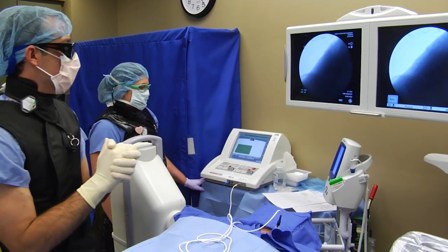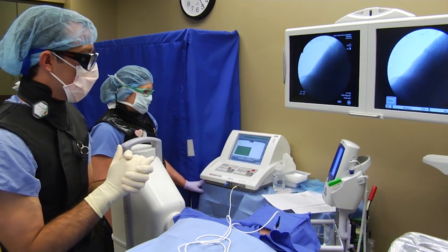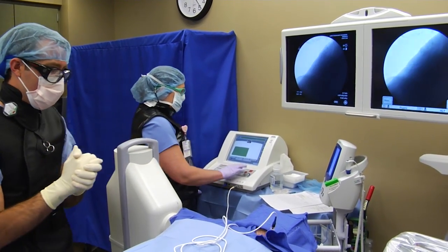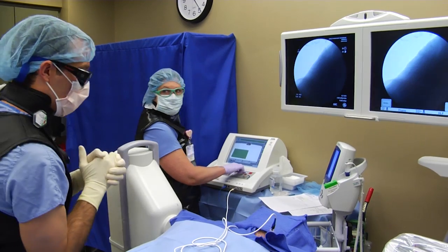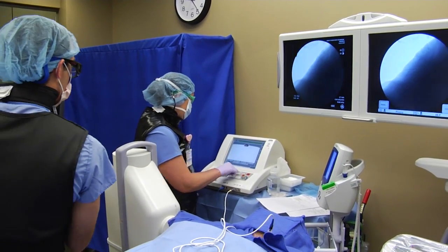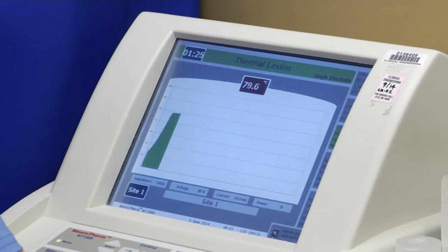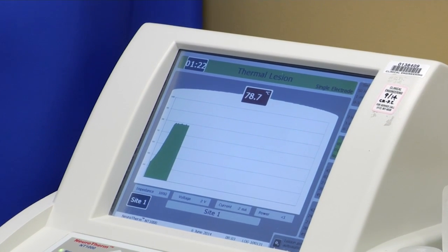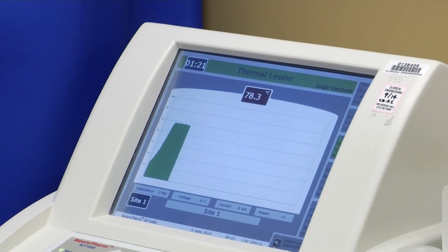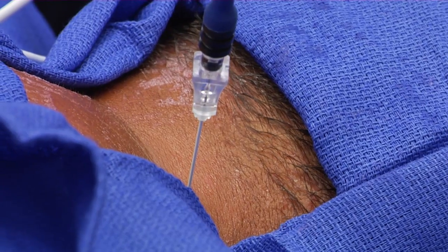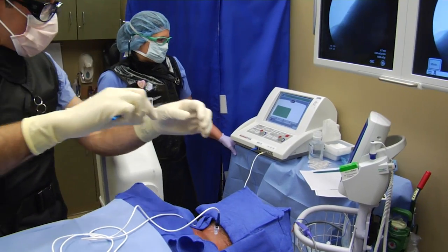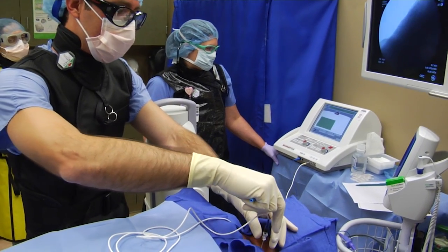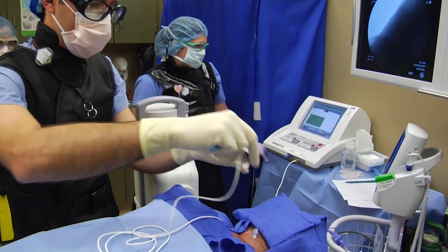On the lateral view, the needle tip remains in the same position posterior to the neuroforamen. At this point, I create another thermal lesion with 80 degrees Celsius being administered over 90 seconds. Then, I remove the inner cannula and insert the trocar back into the needle.